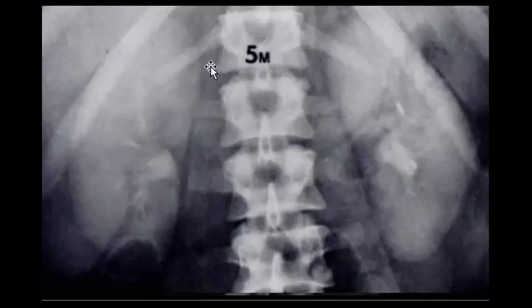Yeah, acute tubular necrosis, hypotension are good causes. And maybe if it is unilateral, but it's not in this case, you can think about renal artery or renal vein thrombosis, obstruction and pyelonephritis. If it is unilateral, not bilateral, okay?